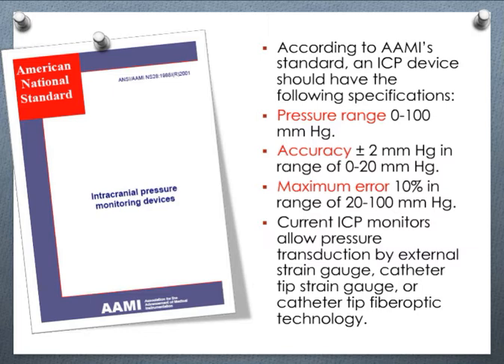This standard criteria needs to be applied also to the ventricular system because you become the producer. You buy a transducer from a company, you buy a catheter from another company, you put the two devices together, and you have to be sure that in your hands these criteria have been respected.